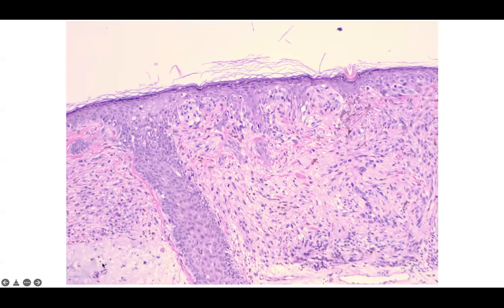And you can see that there are some areas of the dermis which just show normal fibroblasts and abundant solar elastosis. So this atypical melanocytic proliferation actually pushed down and pushed the solar elastosis downward. This is your typical appearance histologically of lentigo maligna melanoma.